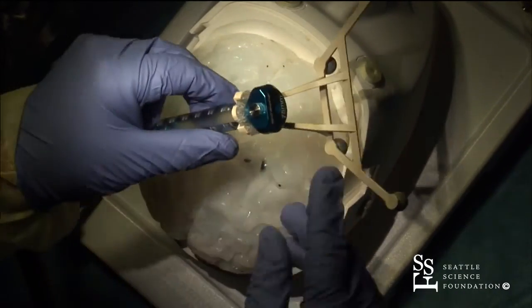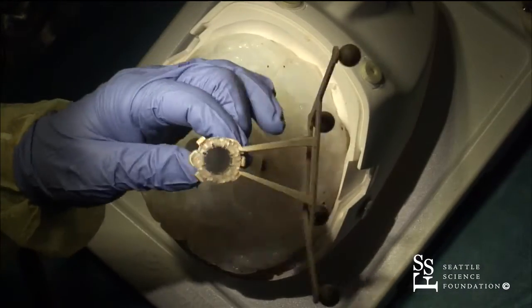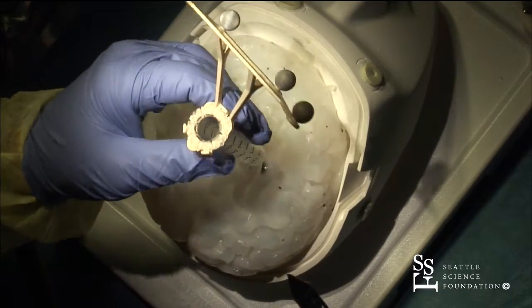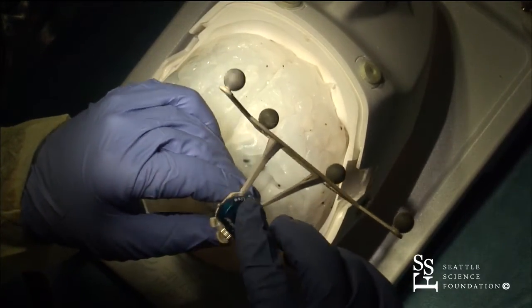Here's what the port looks like. There's the obturator and then you'll be operating down this tube. There are different lengths — up to 65 millimeters — and they're coming out with one even longer than that.